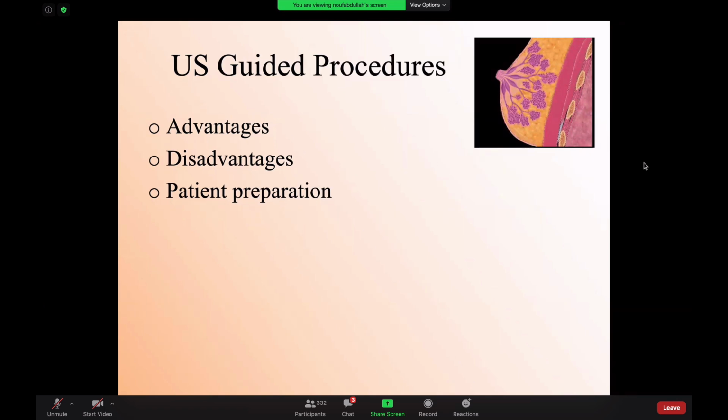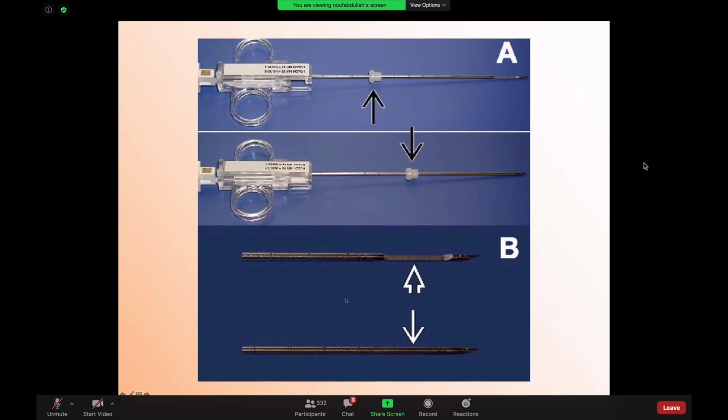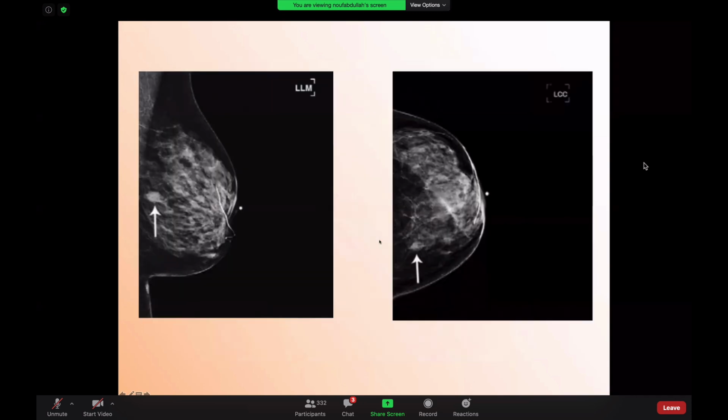How do you prepare the patient? Usually the patient is put in an oblique position. You put the side of the breast that you want to biopsy up, and then you can use any of these needles to biopsy the lesion with ultrasound. You have your probe, and then you will go with either a lateral or medial approach. Your needle will always be parallel to the chest wall. You will never go perpendicular, and you will insert your needle and do the biopsy.